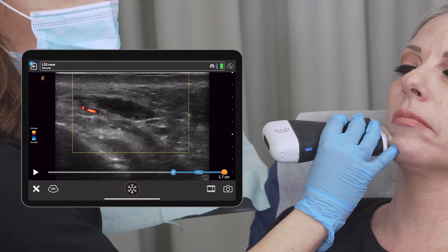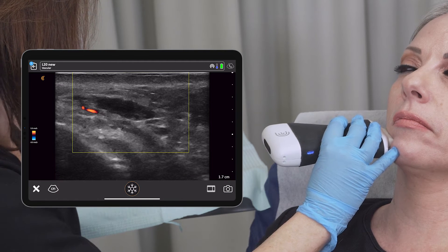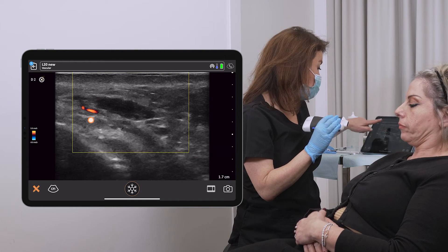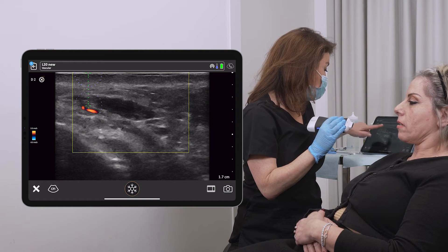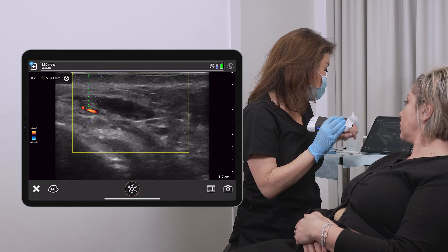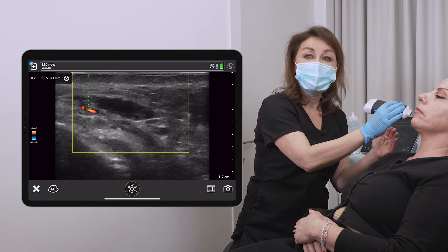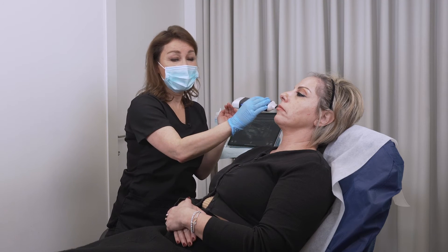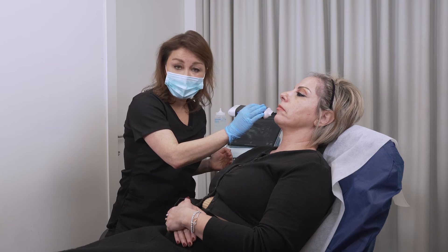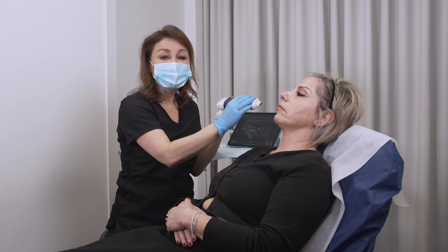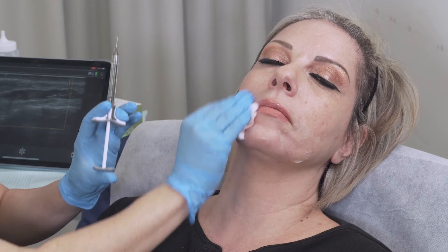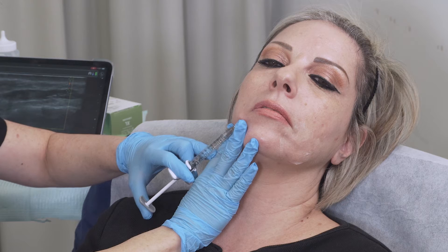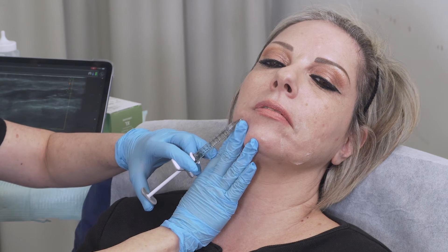Here on the lower side of the marionette fold, the inferior labial artery is also visible. Measuring it, it's a little bit deeper as we go lower into the fold. So I know I have to be more superficial in some areas, especially in the upper part. In this case I'll start injecting quite superficially, so I'm good in this area.